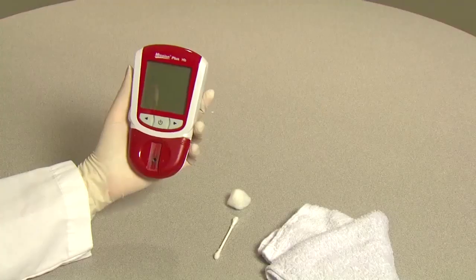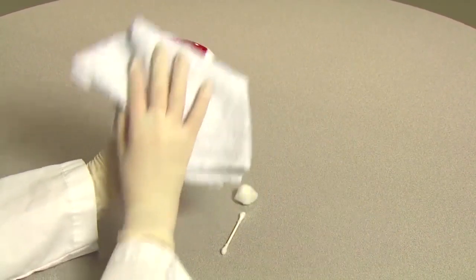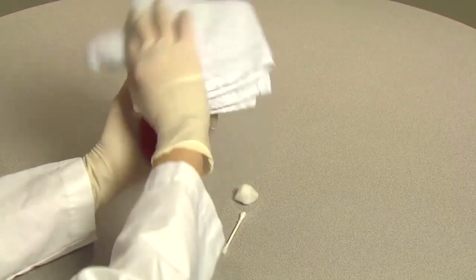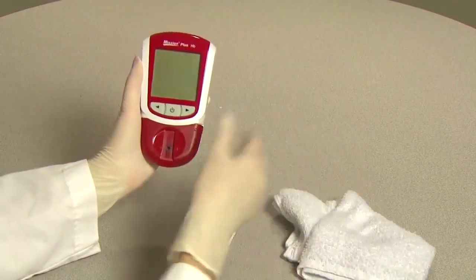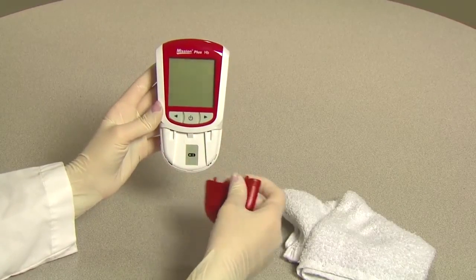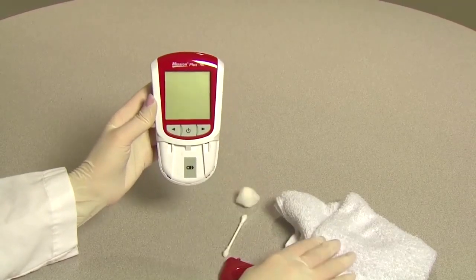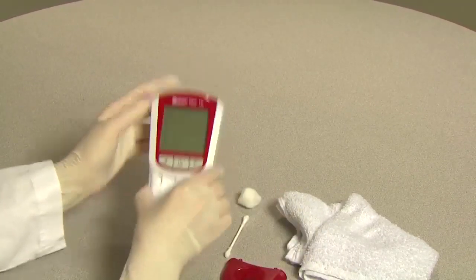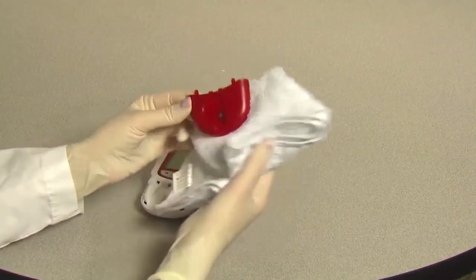Maintenance. For best results, the meter should be cleaned after each day of testing. Clean the meter surface with a dry or a damp cotton cloth. Use a dry, soft cloth to clean the LCD. Remove the test device or test strip holder by pressing in on the middle of the holder and sliding it out from the meter. Wipe it down with a damp cloth or a mild detergent and dry it with a dry, soft cloth.